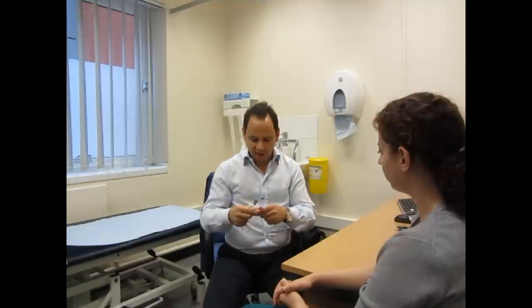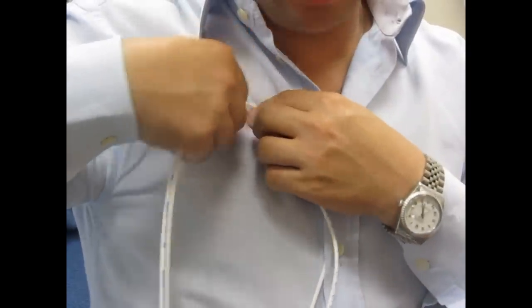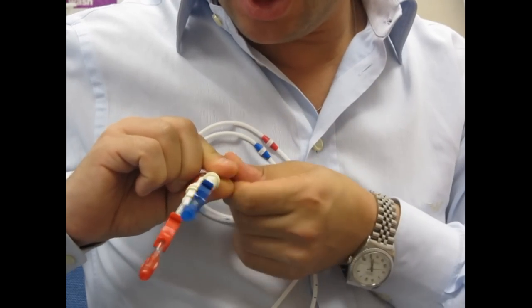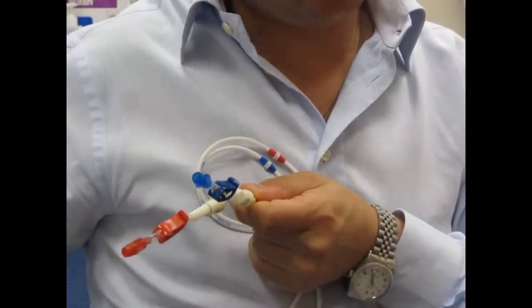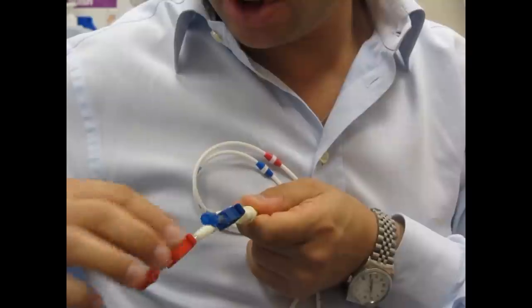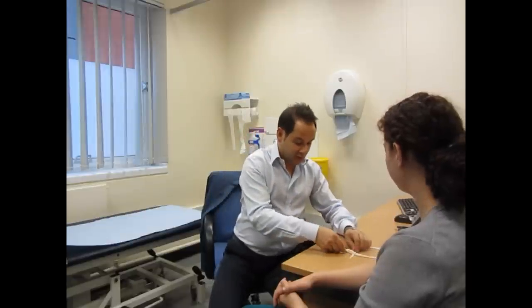Okay, so what happens is that the lines go into the great veins, and some aspect of this plastic is tunneled through the skin and it comes out of your chest wall. Therefore, these two port sites here are amenable to be opened and be connected to the dialysis machine. And so one port site, the blood will come out into the dialysis machine and it will get washed, so all the impurities removed, and the blood is returned via another port. So as long as it's kept clean, it's pretty straightforward, and it doesn't involve any needles like a fistula, which we'll discuss soon.